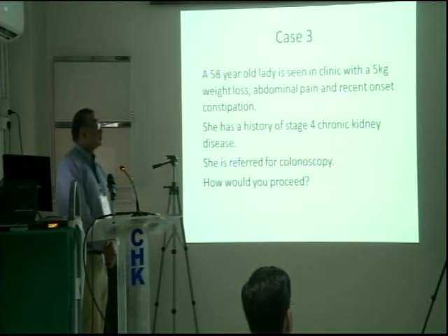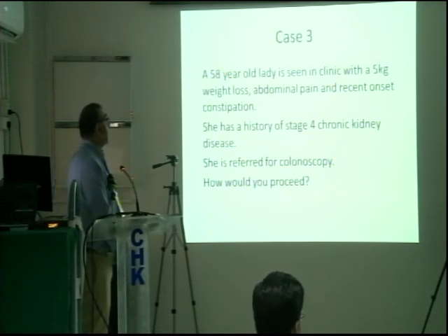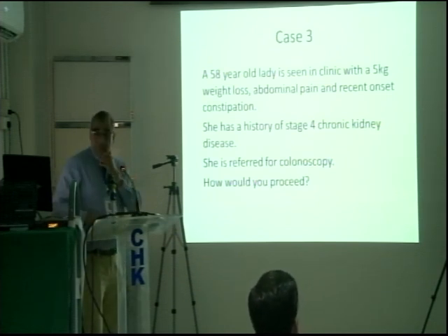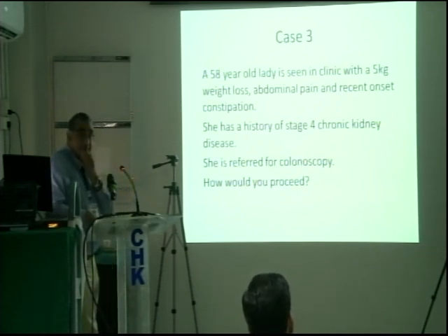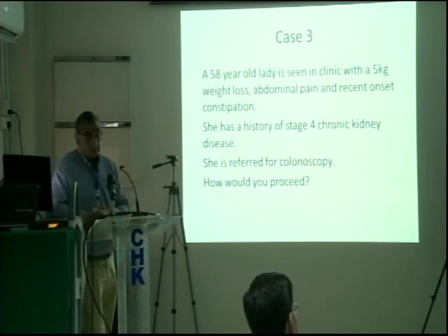Sedation, patient is screaming and you're increasing your loop, which is what usually causes perforation. So unless you're totally deaf and ignorant, you will stop and ask, "Bhai, kya hai? Masla nahi ho sakta." But if you don't have that, in general anesthesia, patient is not going to tell you or scream, and the loop can continue and you can perforate. So if you're doing it under general anesthesia or propofol, you become even more careful.